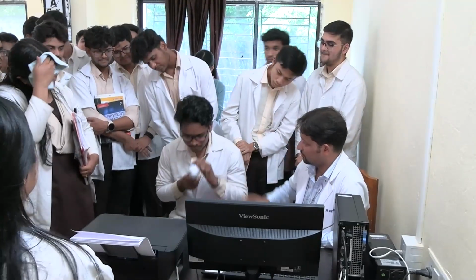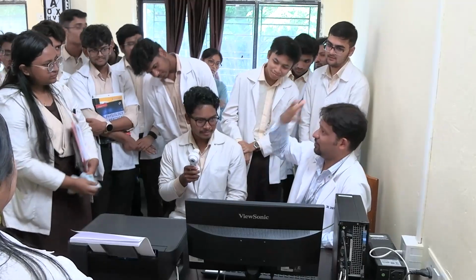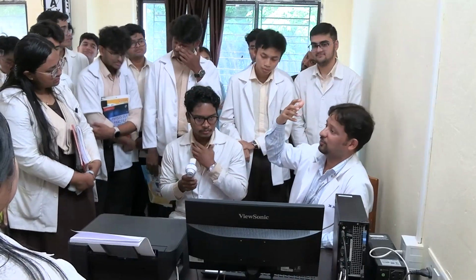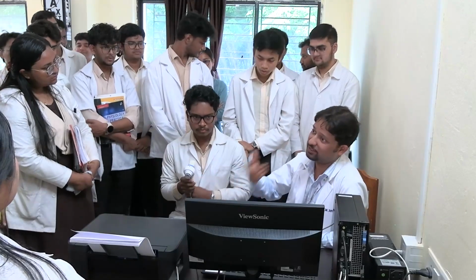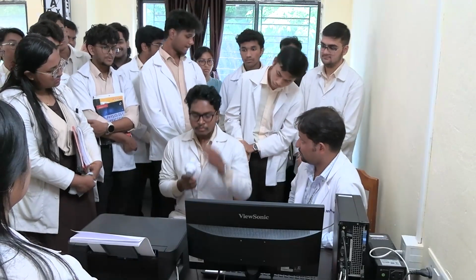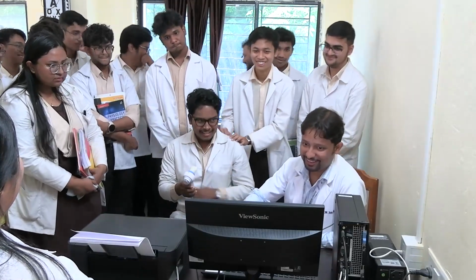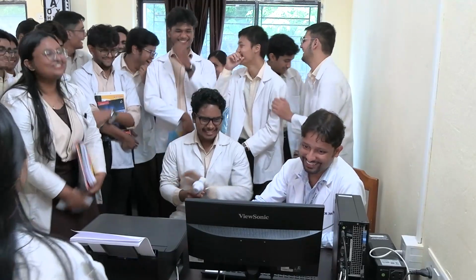Okay. First take a deep inspiration. So what is the reason? If you do not take as much as you can, so what will you exhale out? So that part is very important. But this time, I have not started the recording.